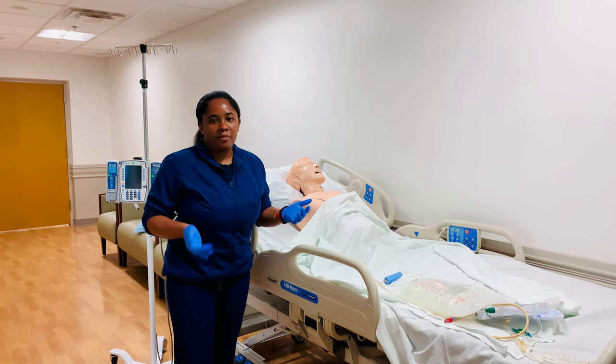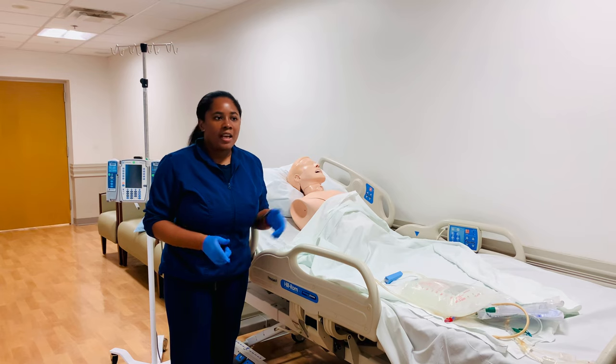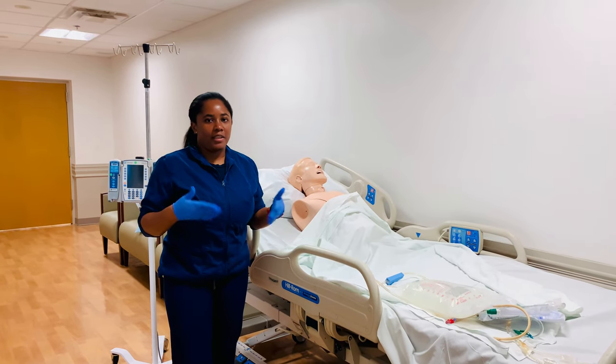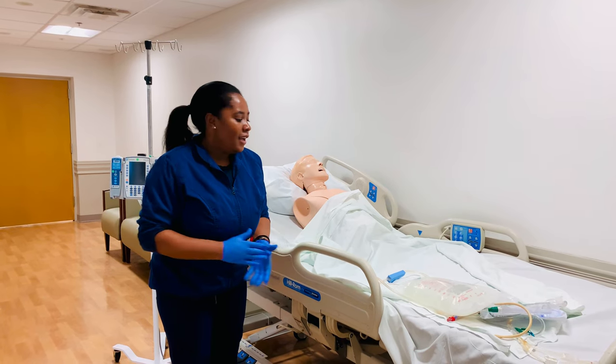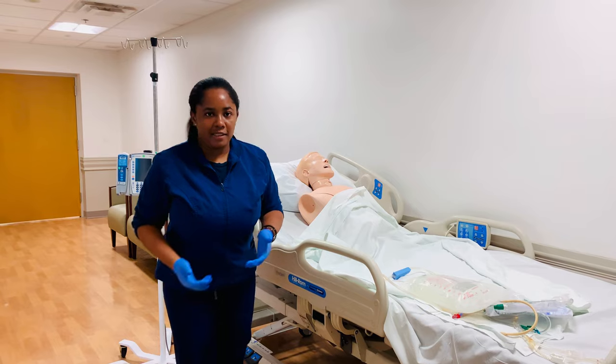Before we begin, just like any procedure we have done, you want to make sure that you're identifying your physician orders, identifying the correct patient, and making sure that you're practicing the rights of medication administration — because anything you're hanging, like normal saline, is going to be considered a medication. So first, make sure you are gathering all of the supplies that you need.